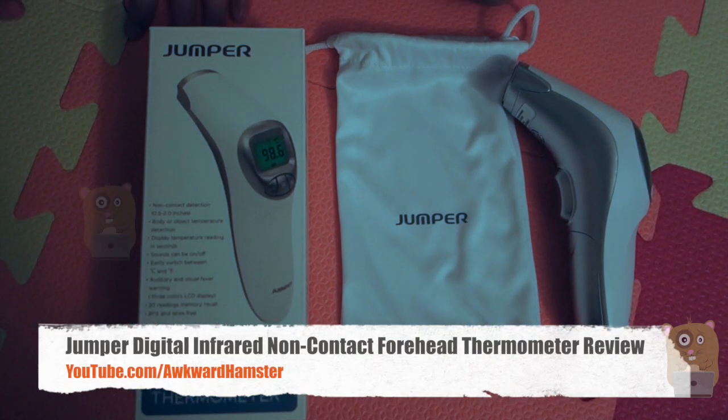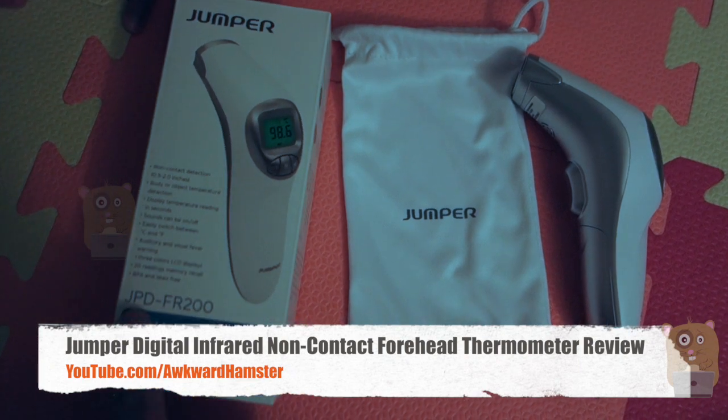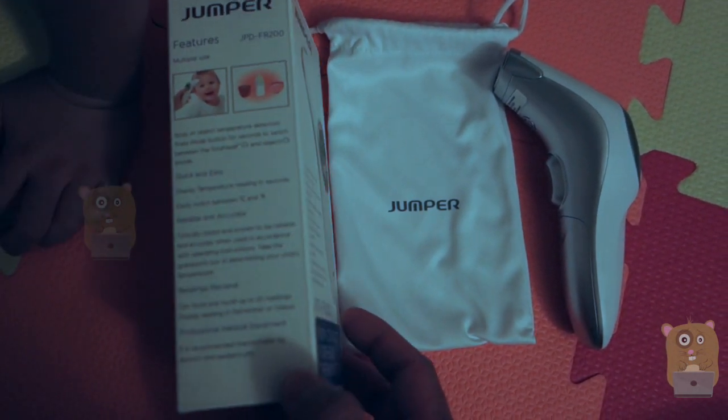Hi, welcome to Ogle Hamster. Today I'll be reviewing this Jumper non-contact digital thermometer. Here's the model number, and this unit costs roughly $30 on Amazon.